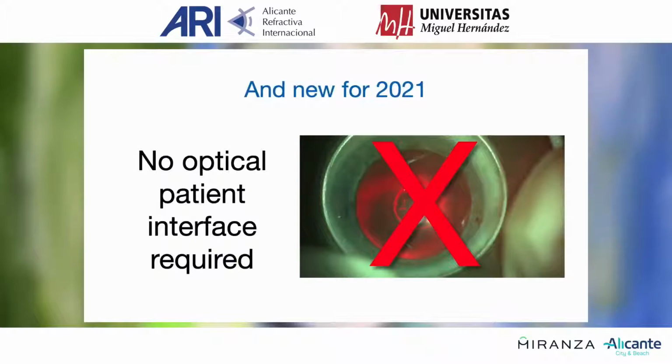And this year, due to modulating the way that the laser performs and its settings, it is no longer necessary to have an optical patient interface. This will reduce cost, but it will also mean that the ability to focus the laser is much enhanced, and the surgeon's view also.